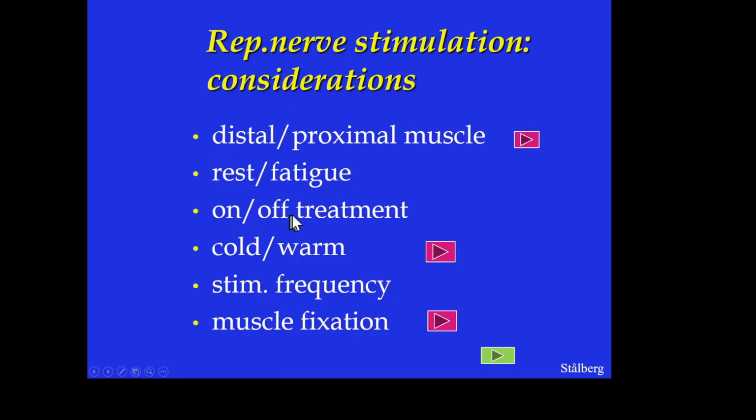On-off treatment, that is particularly for the cholinesterase inhibitors, that we put the patient off treatment if possible for 12 hours before testing.